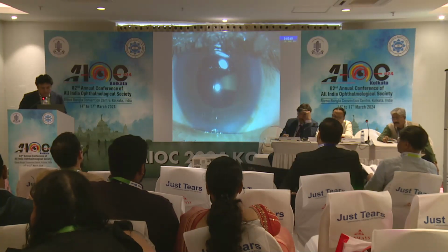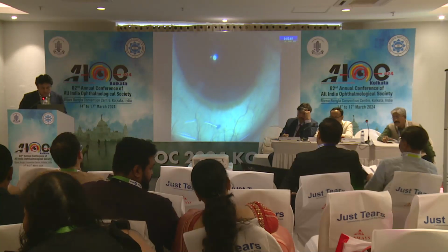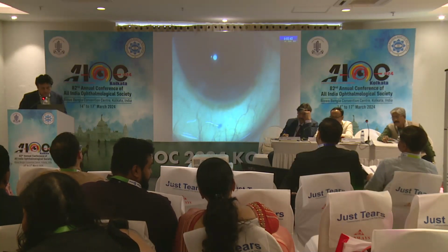This is the final slit lamp picture of a well-centered IOL with a clear visual axis. And here too, the flanges can be appreciated.